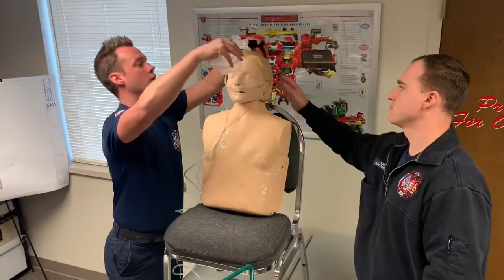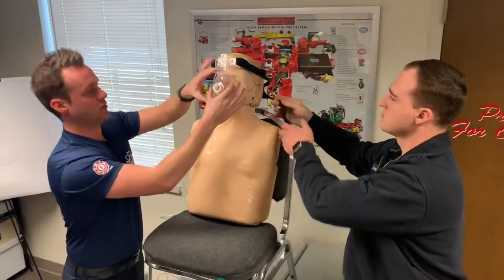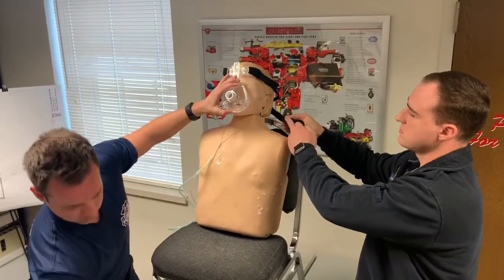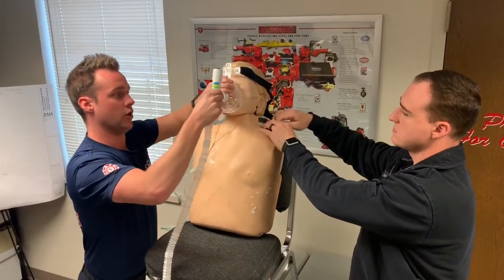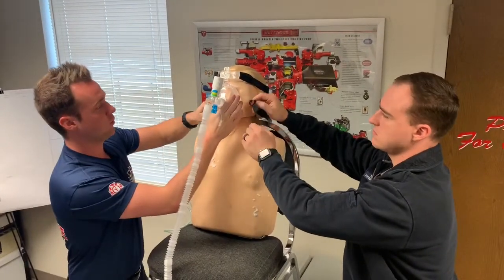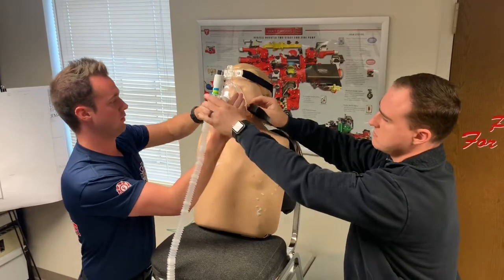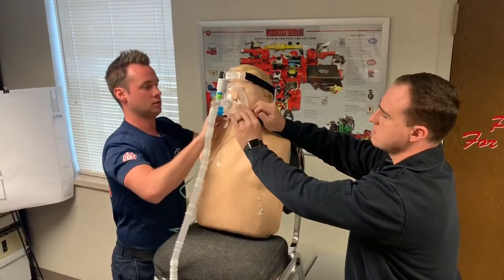So we want to come over the top of their head. And at this point, you can be holding it to their face and create a seal and attach the hose. And the patient can start receiving their treatment while we are still securing the mask to get a good seal.